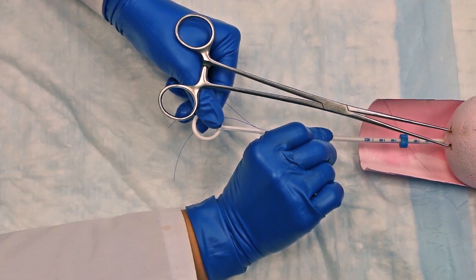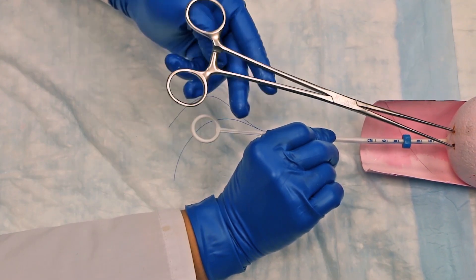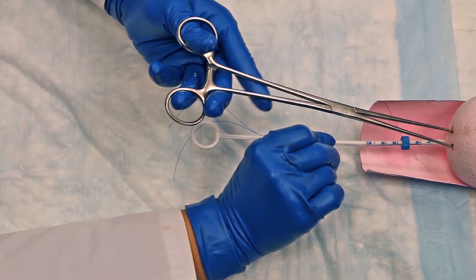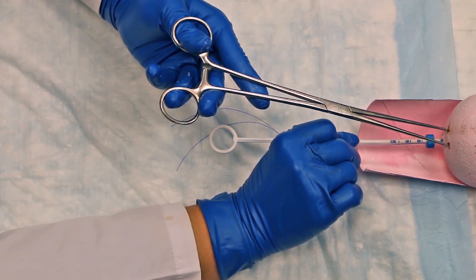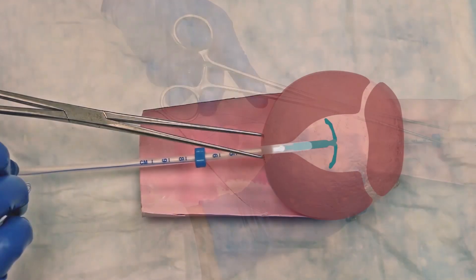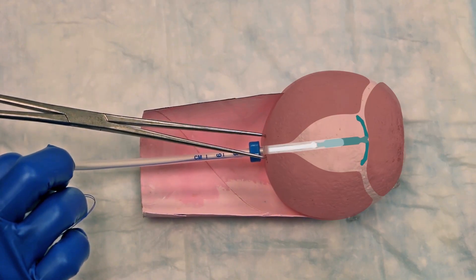You can now let go of the rod and once again apply gentle traction to the tenaculum. Next, advance the insertion tube and rod to the uterine fundus, stopping when you feel a slight resistance. At this point, the flange should be touching the cervix and the IUD should be in place at the uterine fundus.